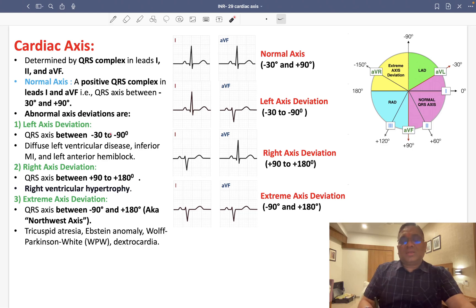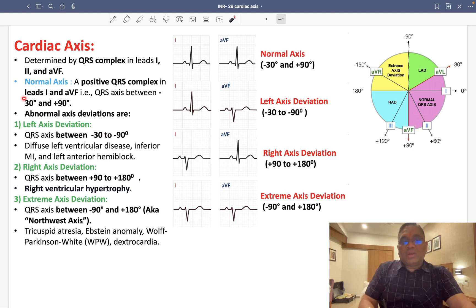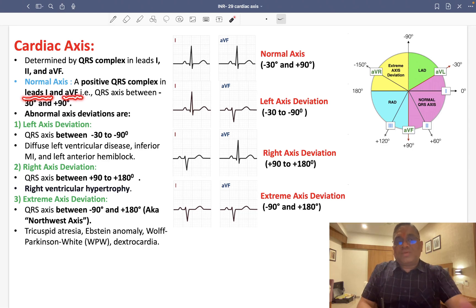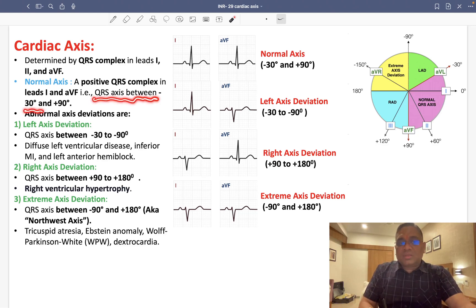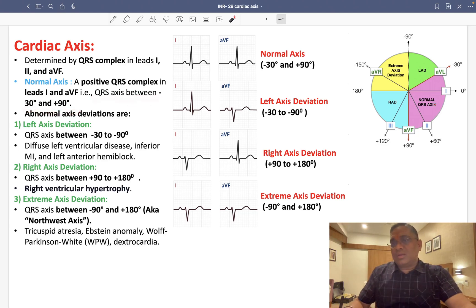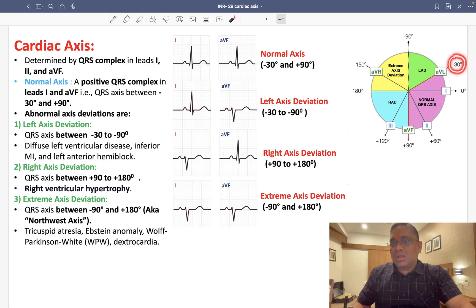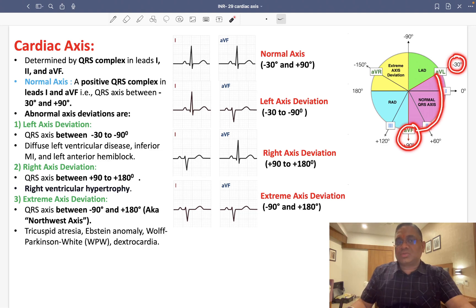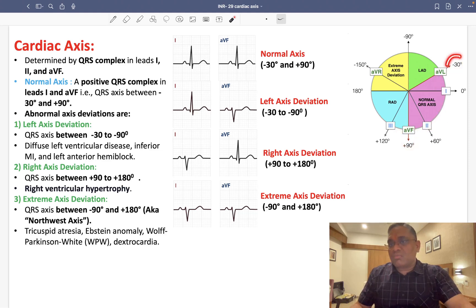We follow the same manner as our standard ECG interpretation approach, looking at lead 1 and lead AVF. A normal axis means the QRS axis will be between minus 30 degrees to plus 90 degrees. So this is the normal electrical cardiac axis, ranging from minus 30 degrees to plus 90 degrees — examiners will ask this question.